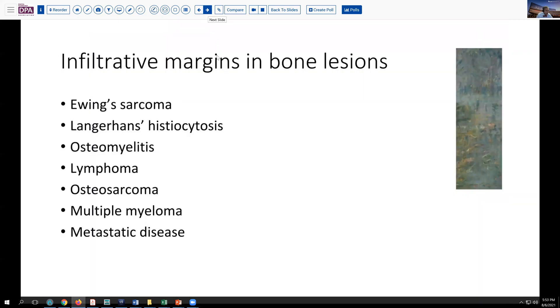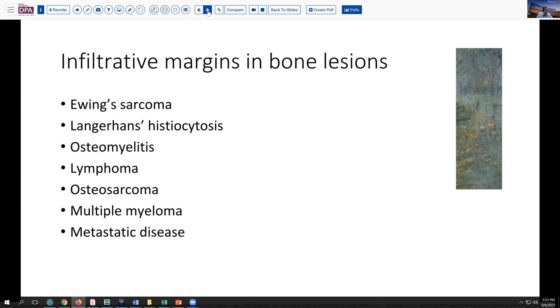This brings up the differential of infiltrative margins and bone lesions. Especially in a child, we're thinking about various significant possibilities. Ewing sarcoma certainly can present in this age group and have an infiltrative and fairly aggressive pattern. Langerhans cell histiocytosis, osteomyelitis could be progressive in this way, lymphomas, leukemias. It doesn't seem too much like osteosarcoma, but a small cell osteosarcoma certainly could have this appearance. And although metastatic disease is not likely in this age group, and certainly myeloma would be extraordinary, I've included those here in the differential radiographically.